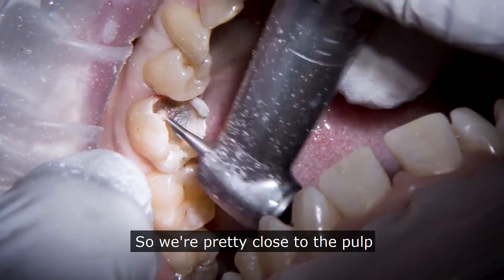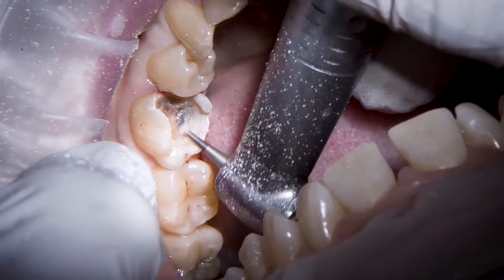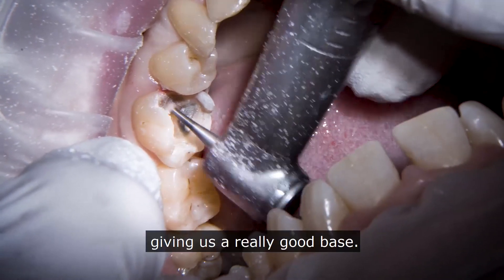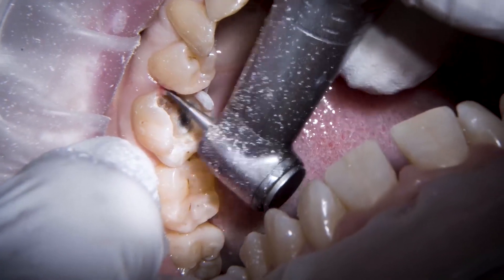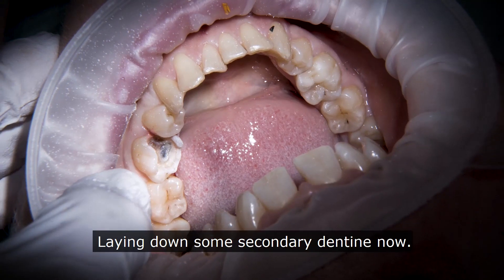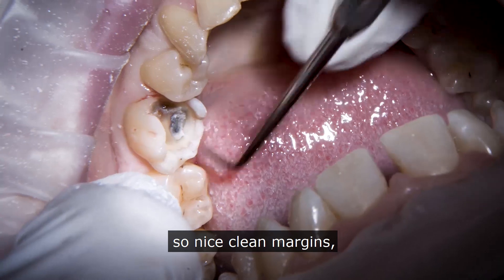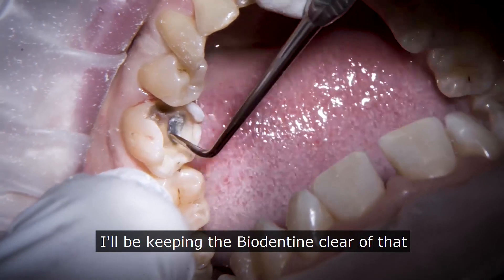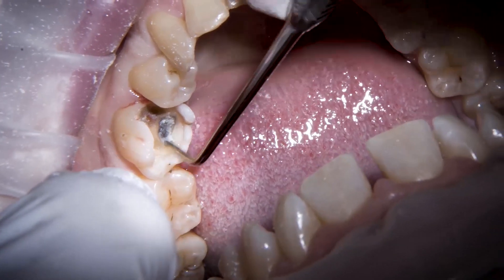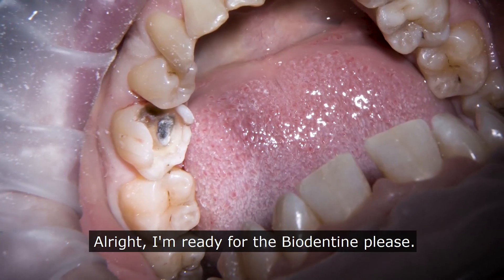We're pretty close to the pulp — no particular near exposures — but this is where the biodentine really just comes into its own, giving us a really good base and starting to lay down some secondary dentine there. We've got some nice clean margins, and I'll be keeping the biodentine clear of those margins so we can get a really good etch around them.